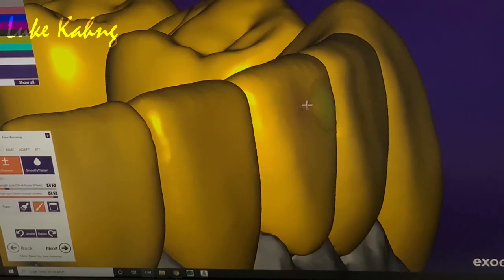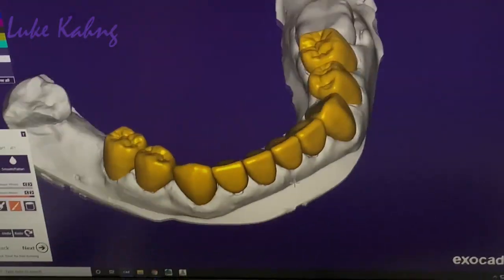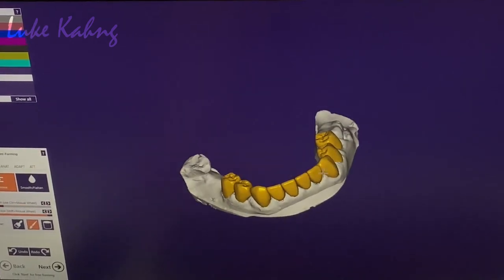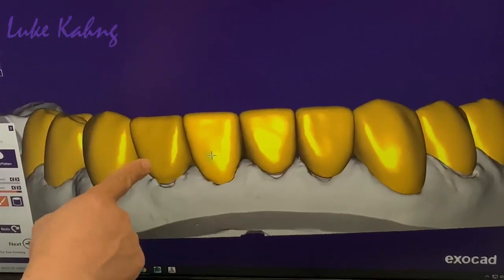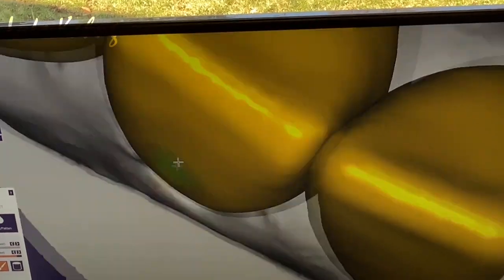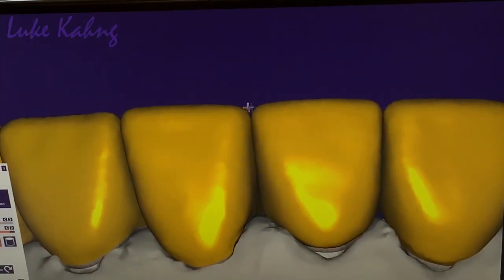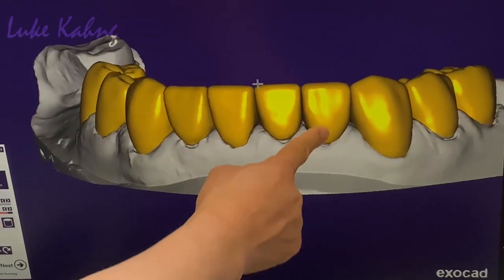Now move on to lateral. How many do you need of this? Upper and lower. Okay, 16. Yeah. Alright, now you go. You see, make it slightly, right? What I'm saying, this is a standard, and then I tweak. Same thing here, flat, right?